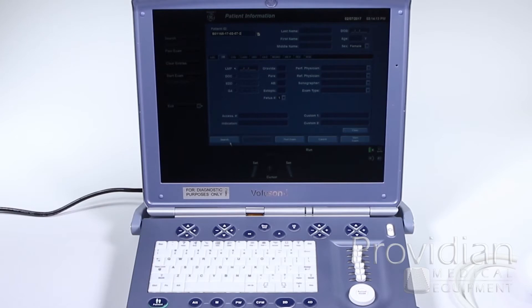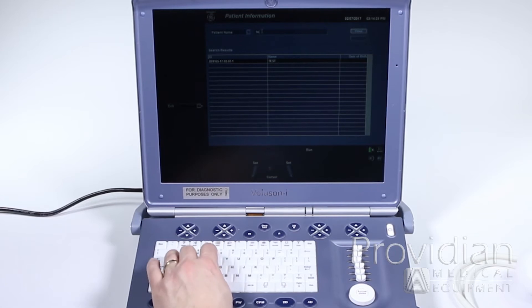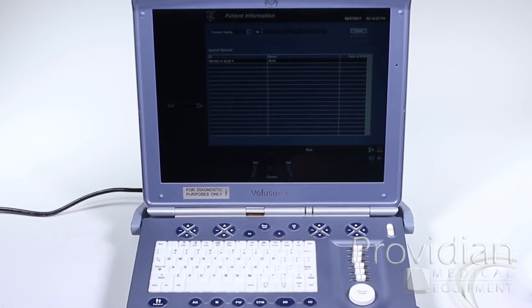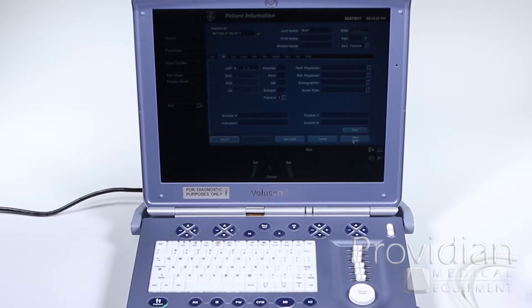If I wanted to go to a previous patient, I can click this search button here. I don't have any previous patients in there, but you can search by patient ID or the patient name. And if I had test in there, I do have a previous one right there. I can go ahead and double click on that one to enter the patient information — this is the test from today — and then I can start a new exam that way and just click start exam.